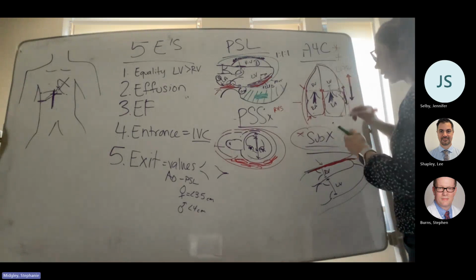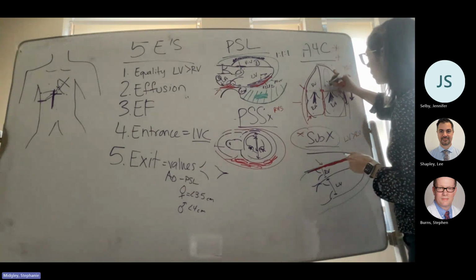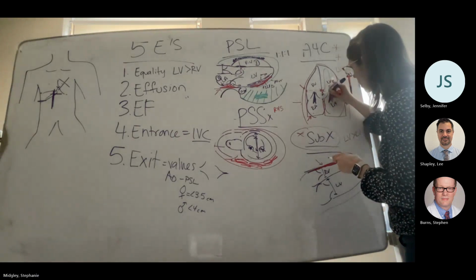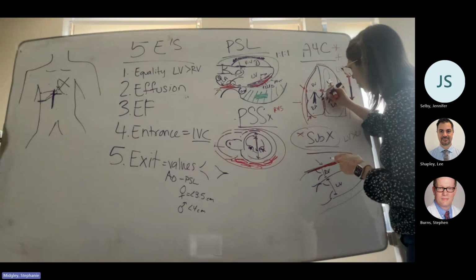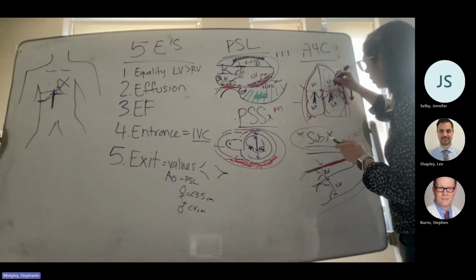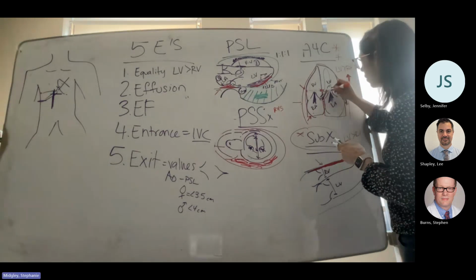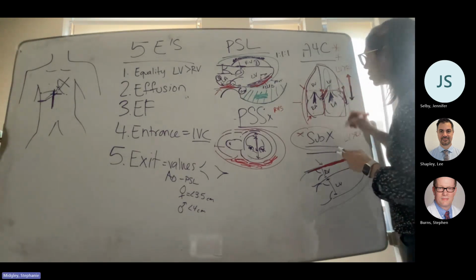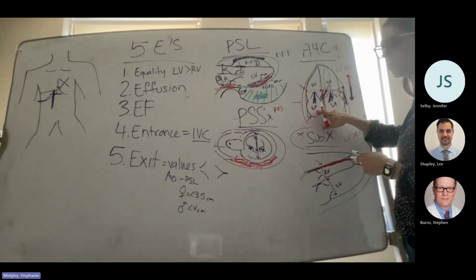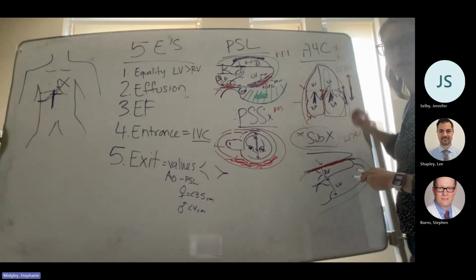When it comes to aortic regurg, if you think about the flow, blood comes into the left atrium, circles around, and then goes out my aorta. And my aorta lives right over here. My little aorta right here. So now if I have aortic regurg, the blood, instead of going out my aorta, is now regurgitating back into my left ventricle. So mitral and tricuspid regurg is going to be blue into the atria. Aortic regurg is going to be red into the ventricle.